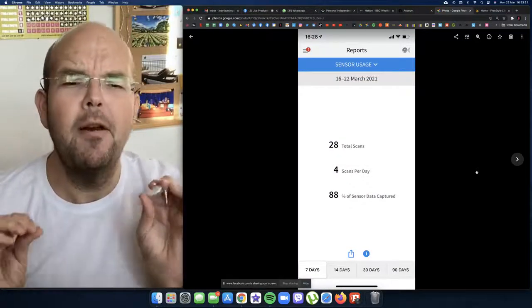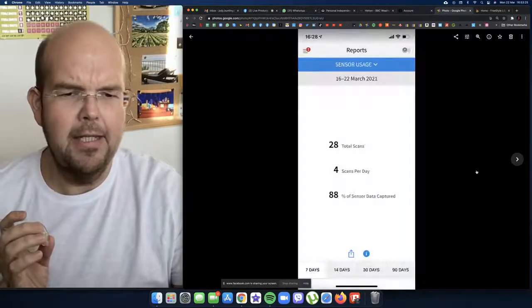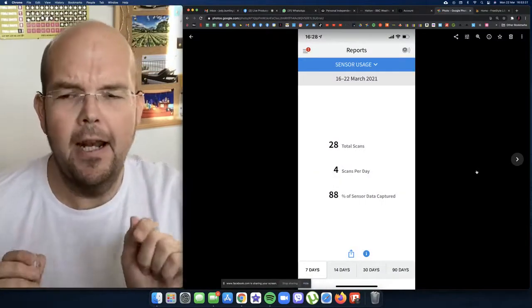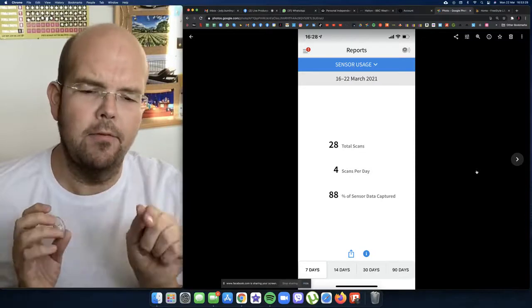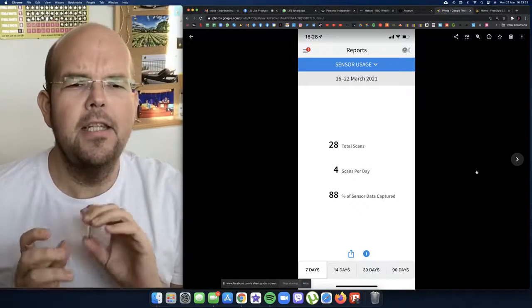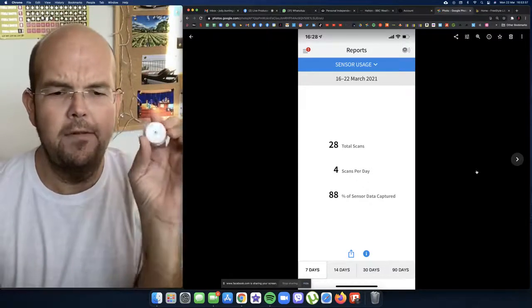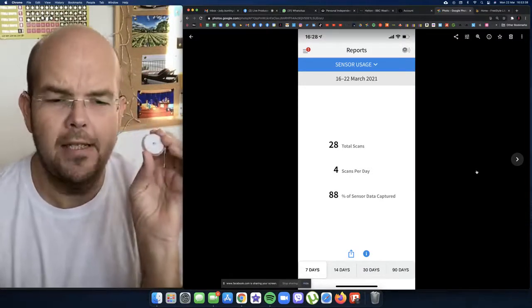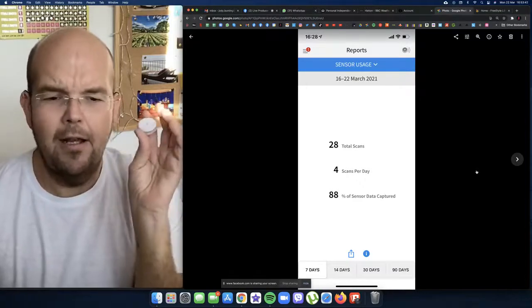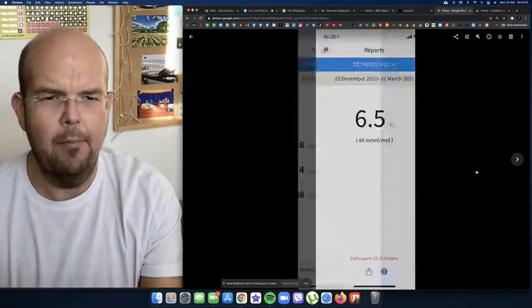These are some of my reports from the last 14 days. You can see at the bottom of the screen I can choose results from 7 days, 14 days, 30 days, or 90 days. For 7 days I scanned 28 times — 4 scans per day on average — and roughly 88% of the data was captured.